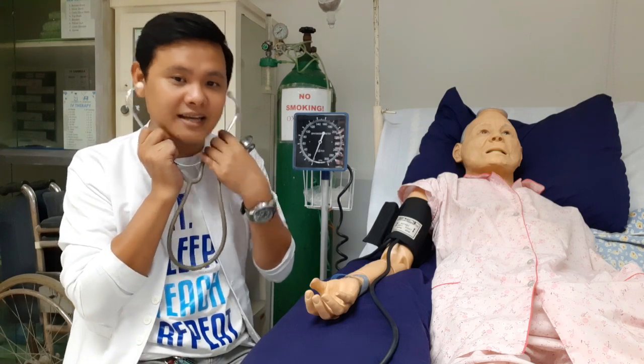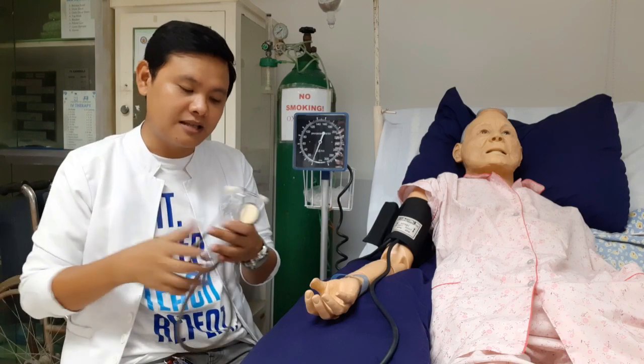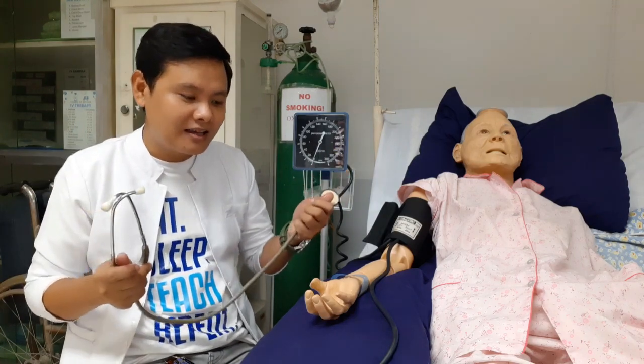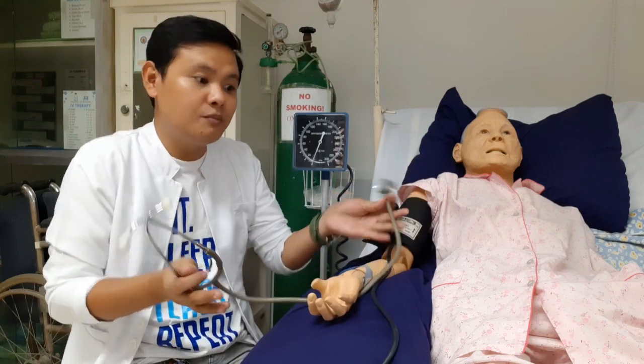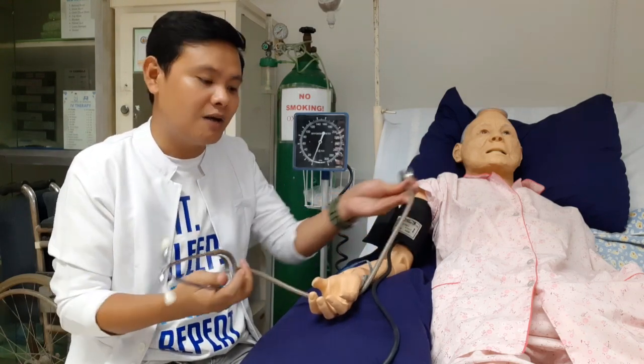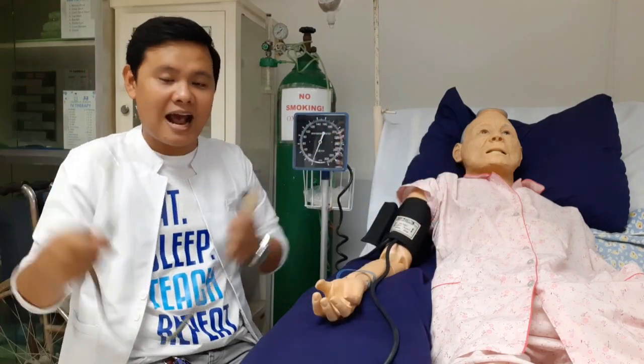Okay, fits. Next, you have to ensure that the stethoscope hangs freely from the ears to the diaphragm. No obstruction. Maybe your stethoscope is under the hand of your patient, so you might hear something different. What you might hear is the friction of your patient's hand. So be sure that it hangs freely.